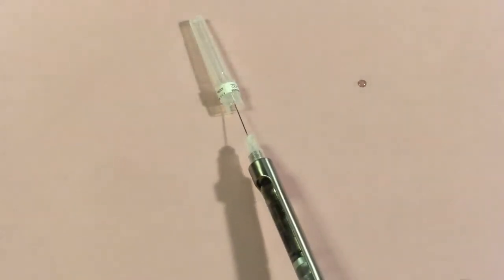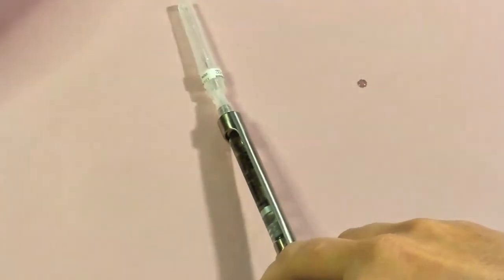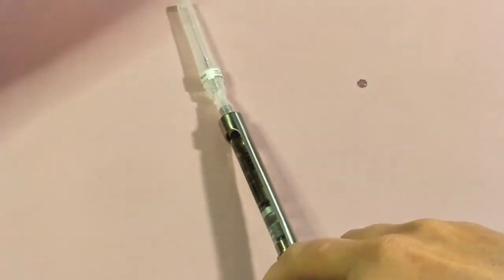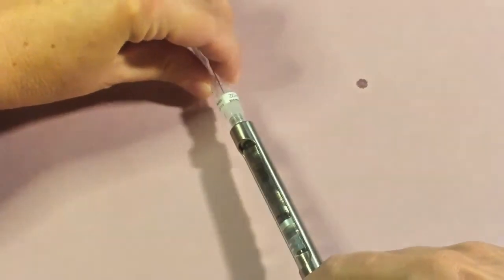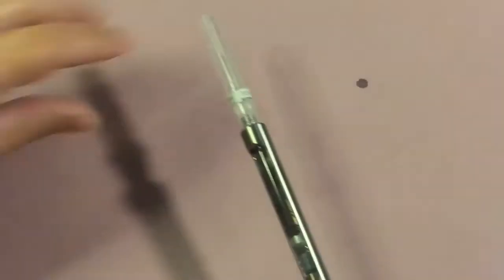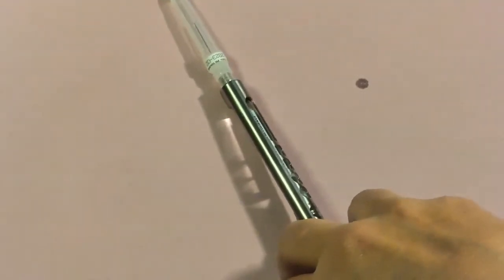Insert the needle into the cap one-handed, and once the needle is inside the cap you can bring your other hand in to secure it back on. That one-handed technique is what we always want to use when uncapping and recapping the needle to ensure safety.